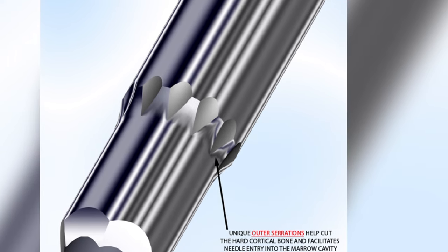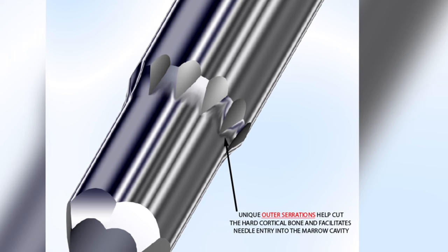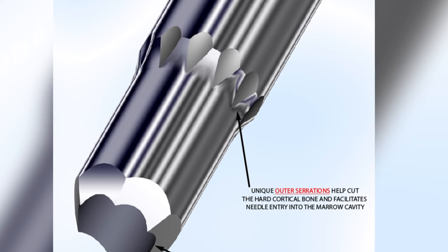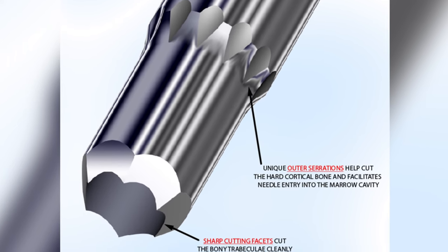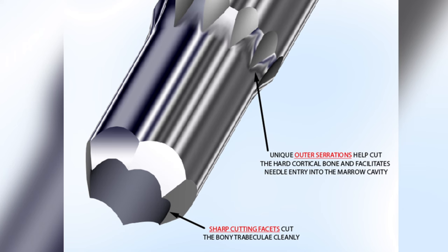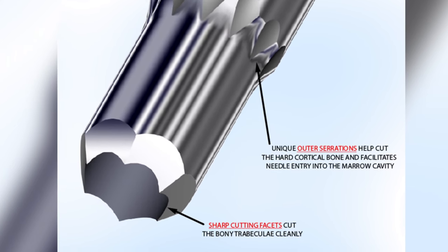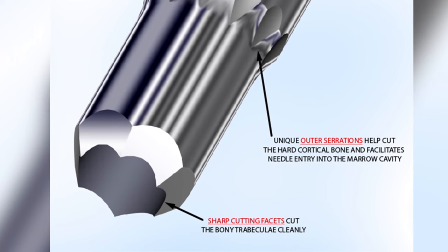In addition, it also has these outside serrations or flutes at the junction of the narrower distal portion with the proximal wider portion. These flutes act like a saw when the needle is rotated, help cut the hard cortical bone, and facilitate its entry into the marrow cavity. These facets are also sharp and help with cutting the bony trabeculae cleanly, thus providing a clean and uncrushed biopsy specimen for histological evaluation.